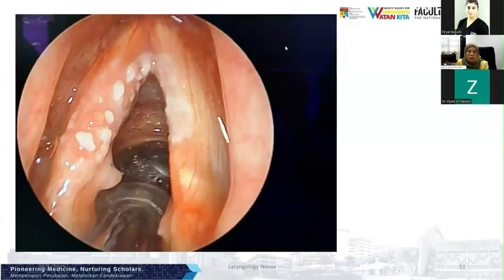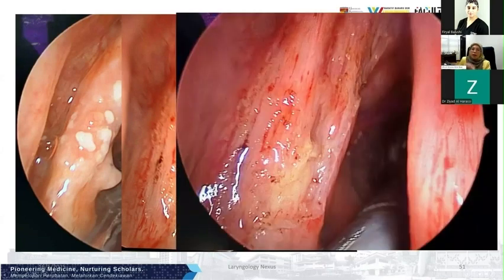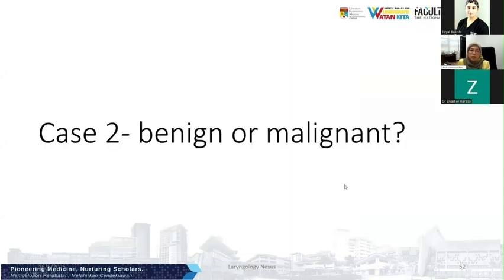The patient agreed to examination under general anesthesia, and a biopsy was taken, and the patient agreed for us to take as much as possible, therapeutic as well, but we do this on the right side in the second stage because we don't know the diagnosis yet, to prevent anterior glottic web. This is how it looks under general anesthesia. For that patient, the biopsy confirmed squamous cell carcinoma.